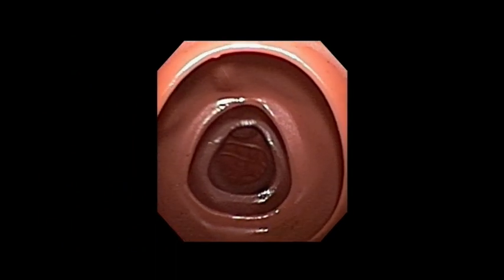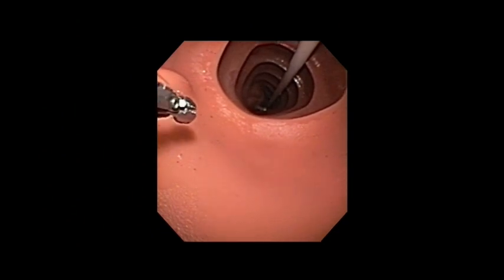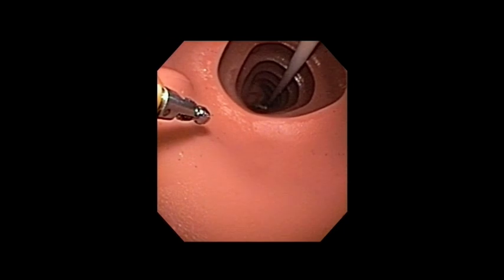Here we see the view from the onboard camera during autonomous retroflexion. Biopsy forceps can also be passed for use in the retroflex position.